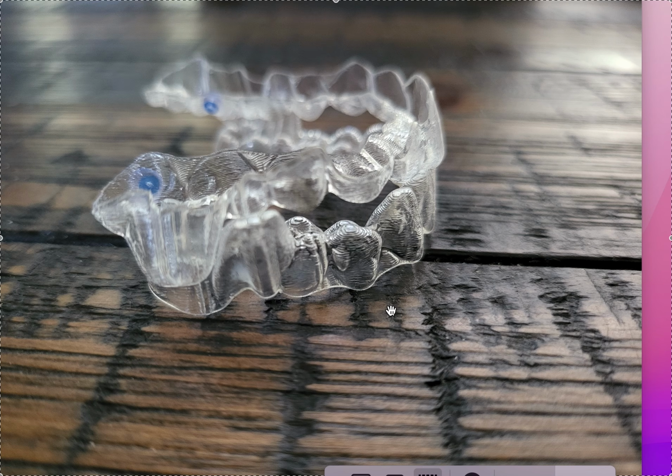Now, for example, in the US, it's there, whether you're a general dentist or an orthodontist. In Canada, it's there, whether you're a general dentist or an orthodontist. Whenever you submit a comprehensive case, it'll pop up as an option that you can pick. It's on the page where, and I have other videos that show you exactly how to do this if you're submitting a case, but it's on the page where they talk about anterior posterior changes.